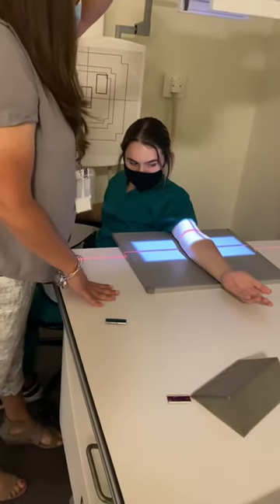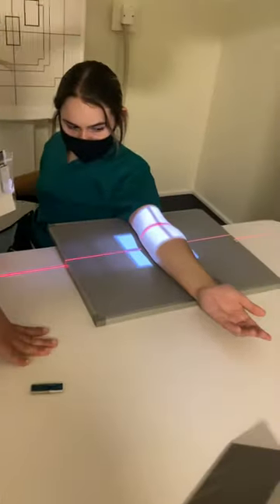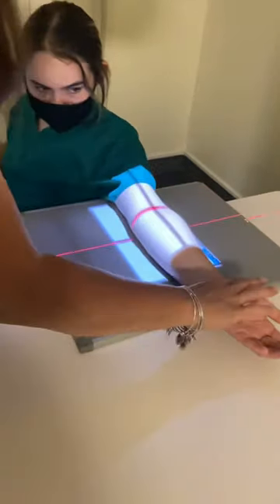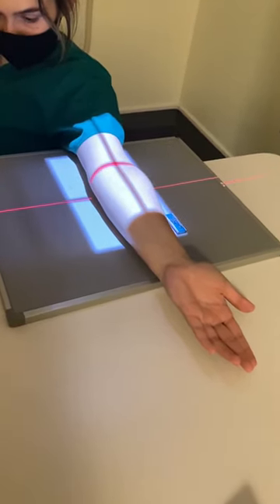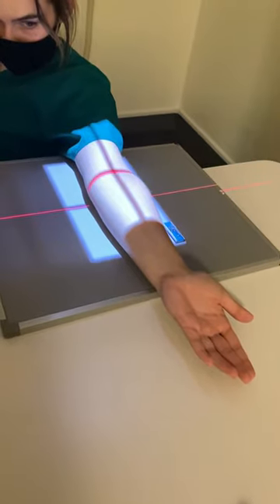I'm going to center right over the elbow joint, and I want to ensure that I get about half of the forearm and half the humerus on my image. My marker's going to go on the lateral side, and I want to make sure that my patient is in a true AP position. I'll have them hold nice and still, and then after that one, I'm going to do the external rotation.